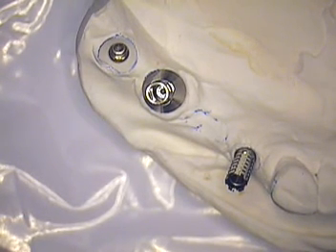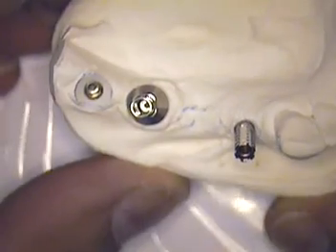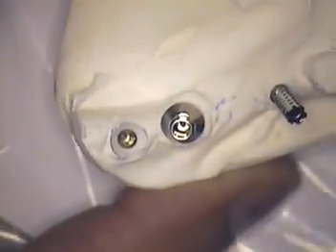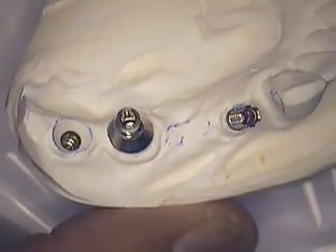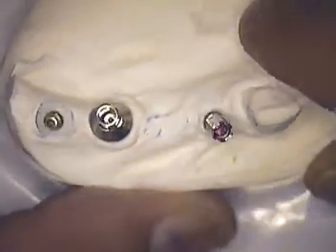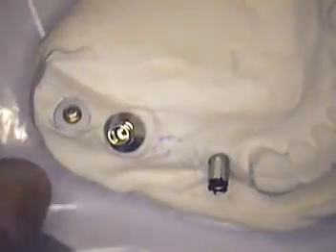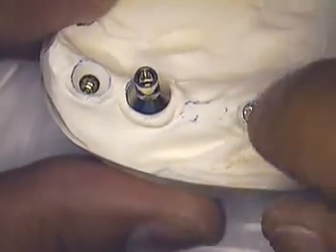Hello everyone and good afternoon. This is Dr. Jerry Cuomo. I'm here in my Boca Raton office presenting this implant case. Sometimes during treatment you may have to wait for a period of time before your implants are fully integrated. There might be some minor bone loss on the x-ray, or you're waiting to make sure the case is going to be stable over time, so you have to make a long-term provisional temporary. The patient was edentulous on the lower right side, and three implants were placed. It's going to be a four-tooth bridge.